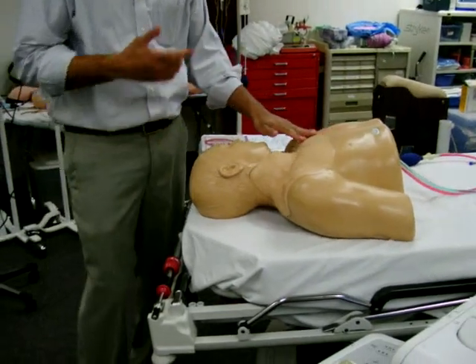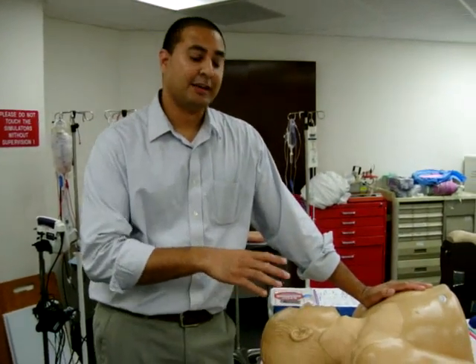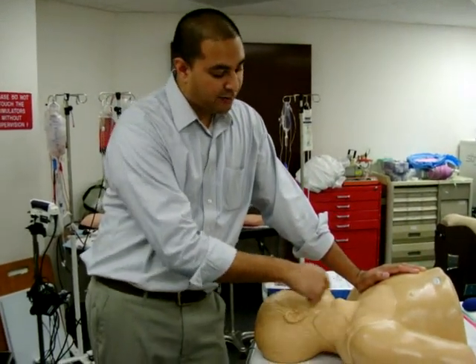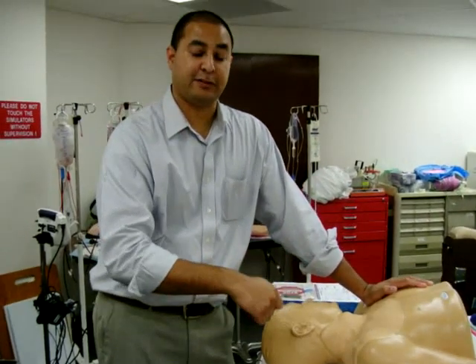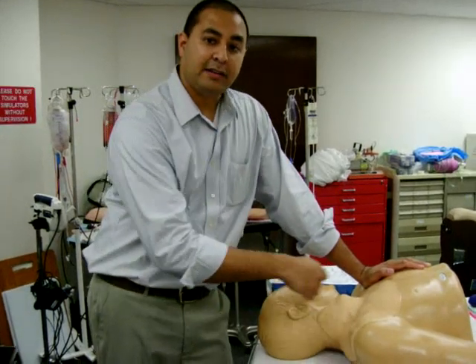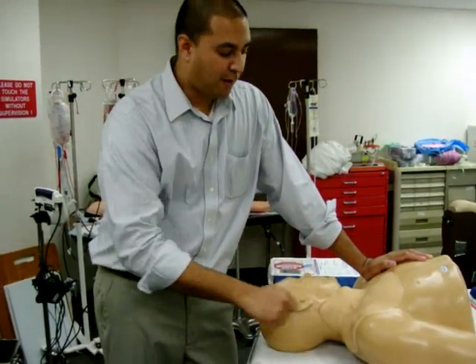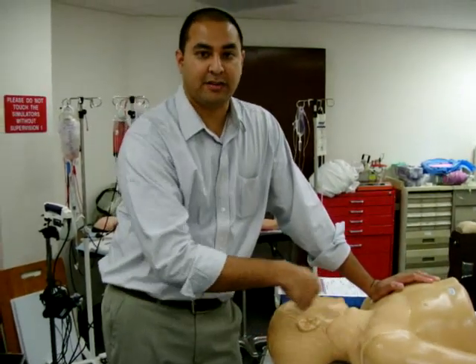Now that your patient's ready, I'm a little bit OCD about cleanliness. At this point, what I would do is clean them up with a chloroprep or a betadine solution. Usually in the hospital we use chlorhexidine and scrub them real good. With chlorhexidine, you do not need to use concentric circles as you do with betadine — you can just scrub all over and go back to your site. Studies have shown that actually cleans better than using concentric circles.